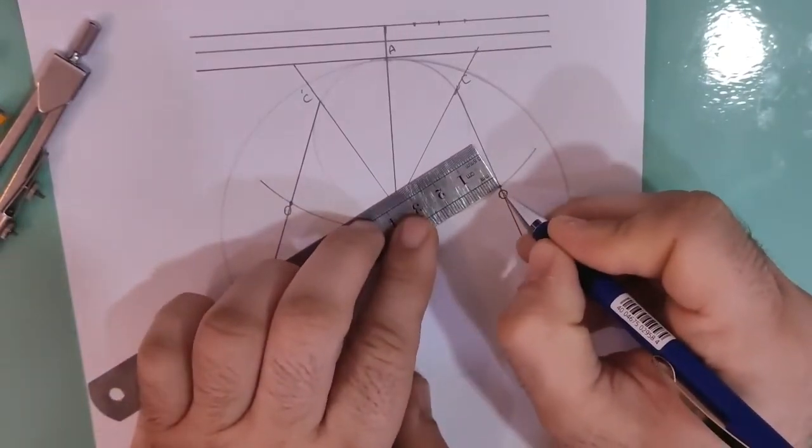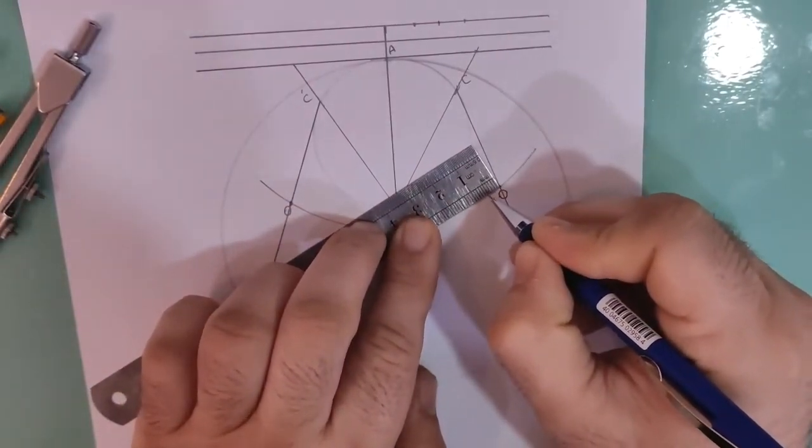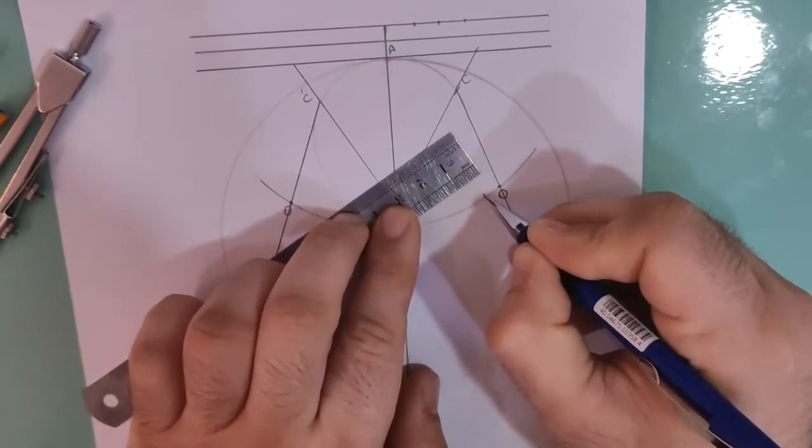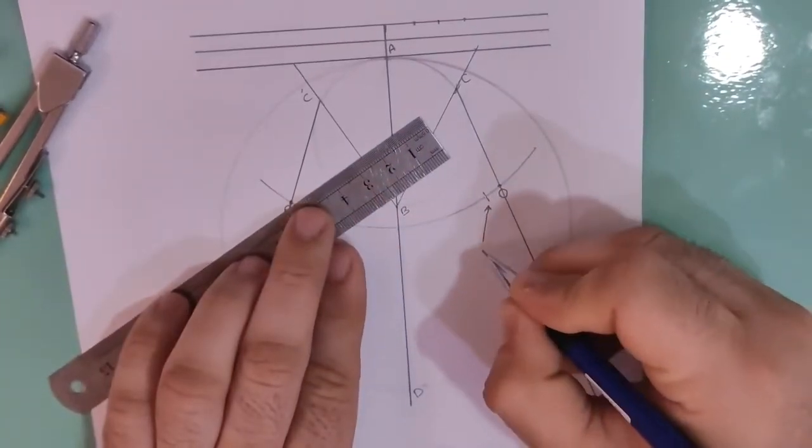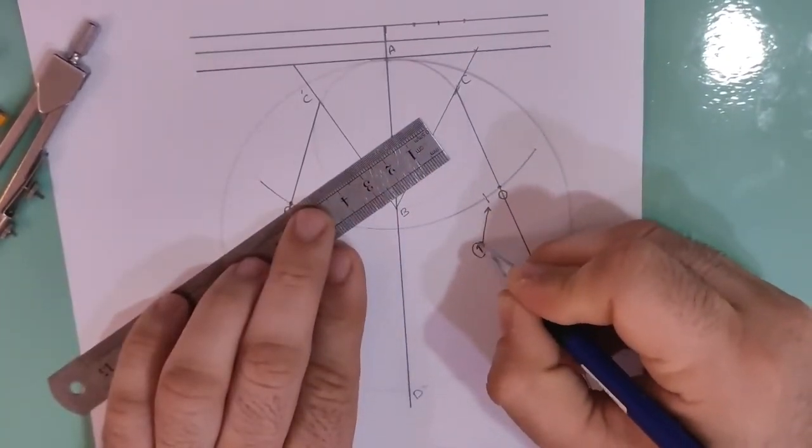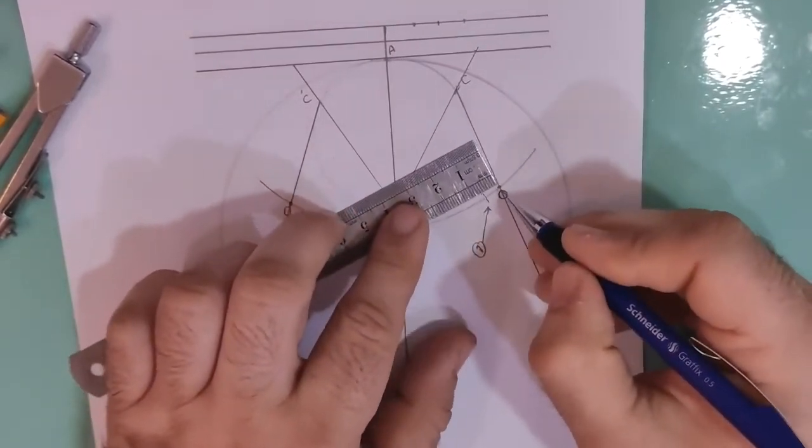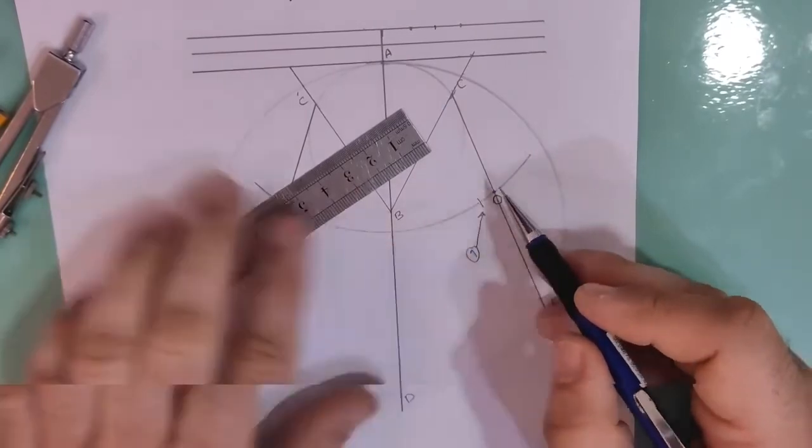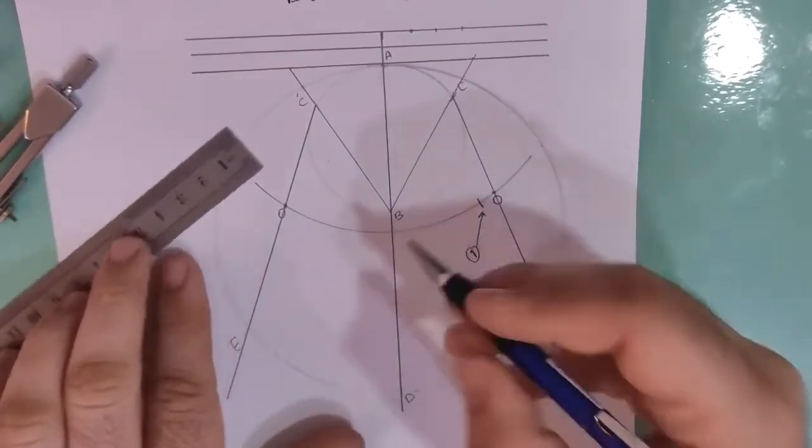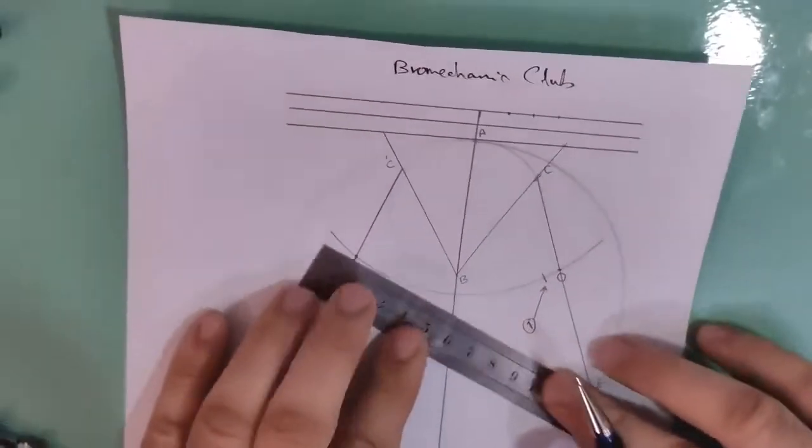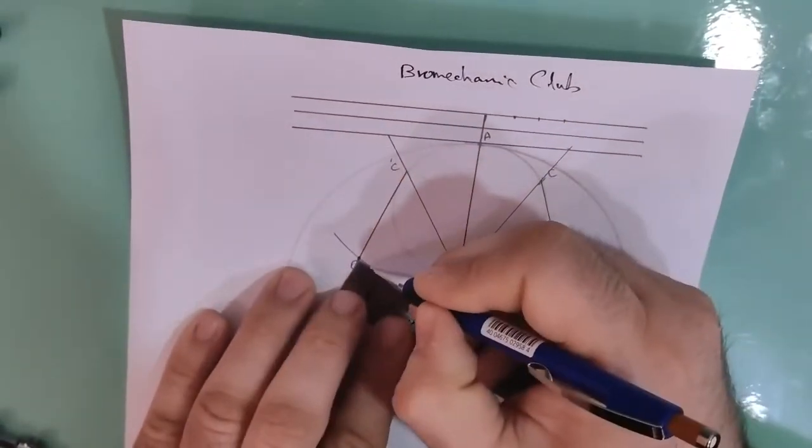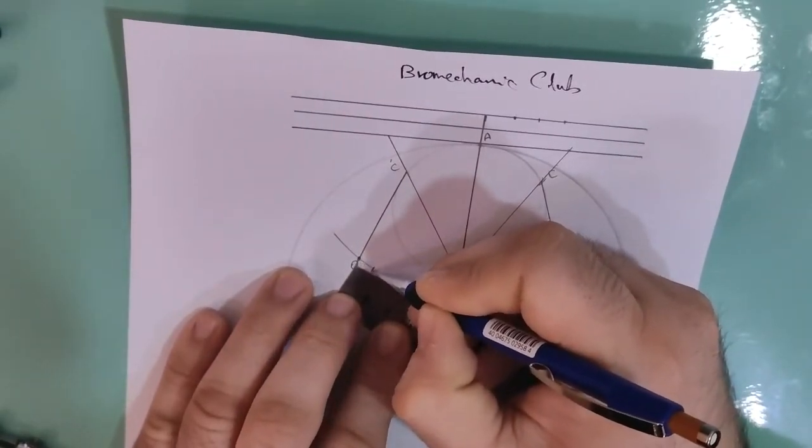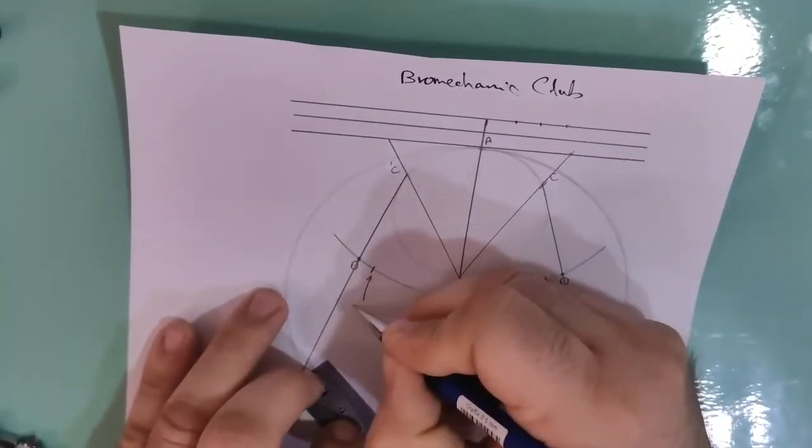So we use this ruler on the arc and count five, six, six and a half. This is called one. Six point five distance from zero. Point one is inner. And here the same. We mark a point distance from zero six point five. Here is one.